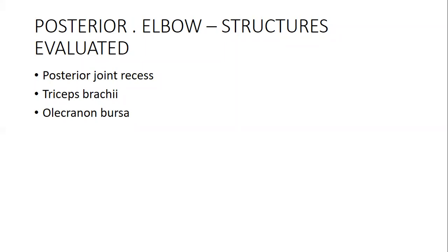And I should also mention here that a normal bursa, generally in the musculoskeletal system or in the body, is not easily seen, but once there is any fluid or any irritation of that bursa, you are likely to have fluid accumulation. What is the key thing here? You have to know exactly which specific bursa you are dealing with. One of the culprit bursas within the elbow joint is the olecranon bursa. Fluid normally accumulates there, there is bursitis there, and the triceps brachii inserts on the olecranon.